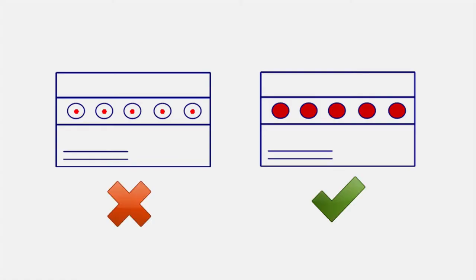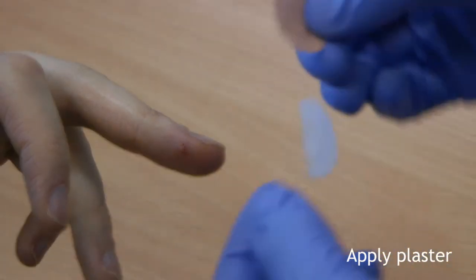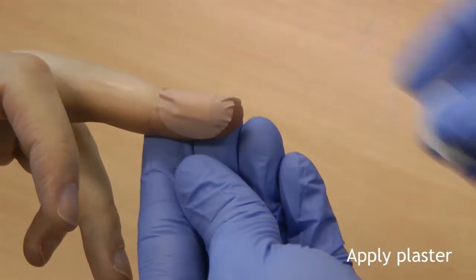Please try to fill each spot with blood, as this ensures the highest test accuracy in the laboratory. If getting enough blood is difficult, use the second lancet and repeat the procedure. Once you have taken the samples, apply the plaster to the bleeding finger. Please try and ensure no blood gets onto the outside of the card or the form.